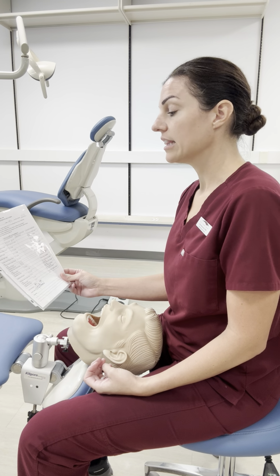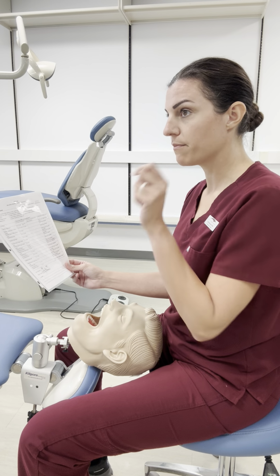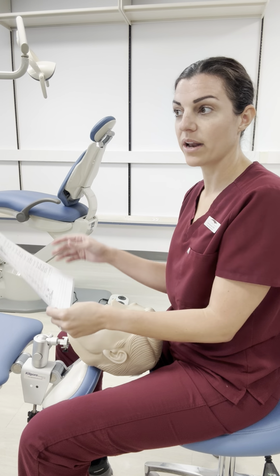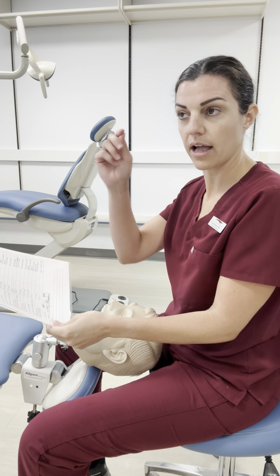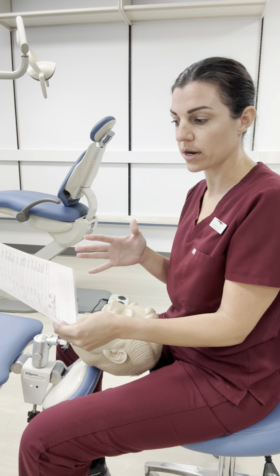Maxillary left lingual. Okay, so you kind of have to picture and point out the area of the mouth. As you're practicing on each other, you'll want to have an instrument like an explorer and be able to point to, okay, this is the area I'm working on. What position will I want to be in?